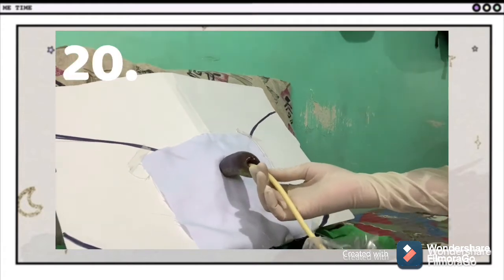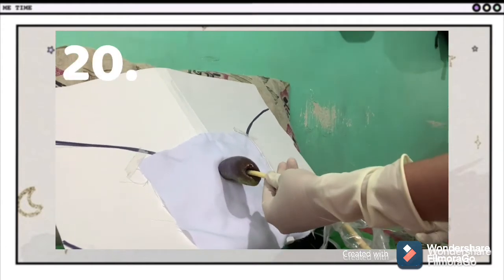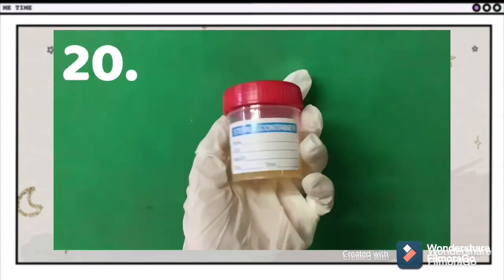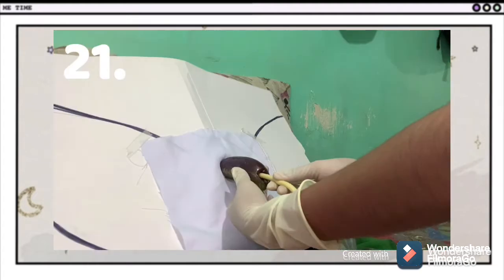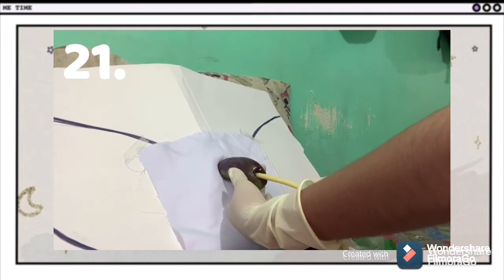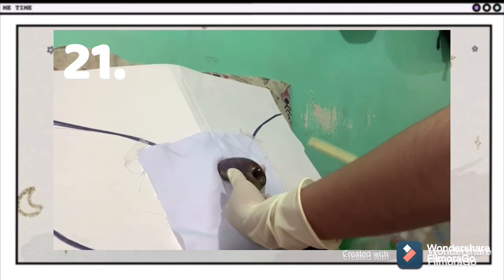Hold the catheter securely with your non-dominant hand while the bladder empties. Collect a specimen of about 20 to 30 ml if required. Continue drainage according to hospital policy. Remove the catheter smoothly and slowly if a straight catheter is used. It is only needed to drain urine, not intended for continuous use.